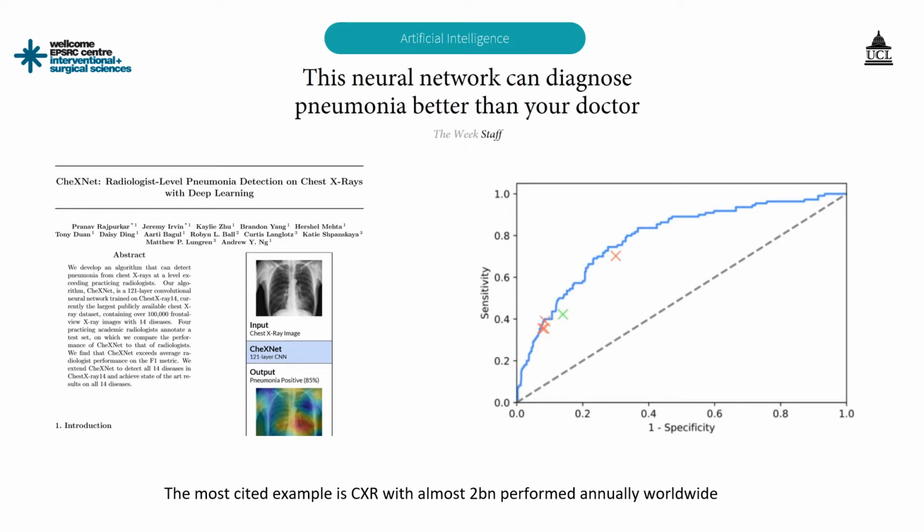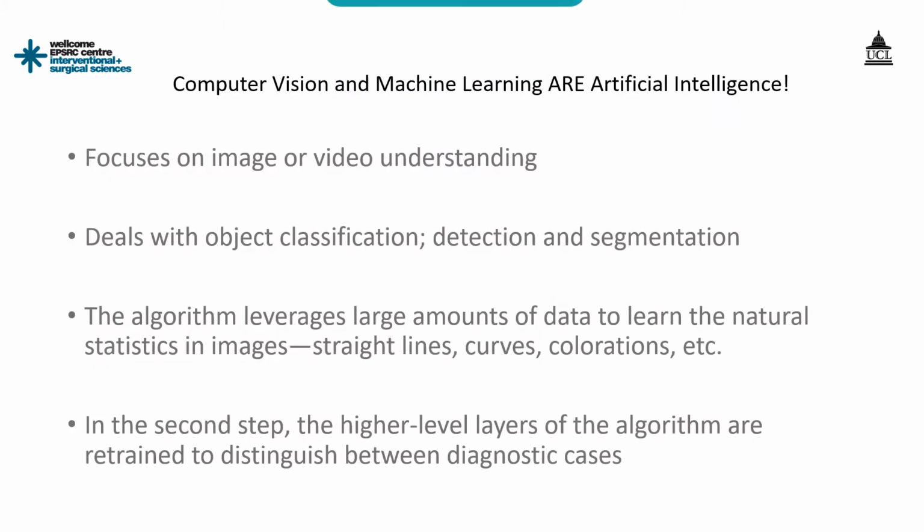Where it begins to falter is if there's more than one diagnosis, for example. So we're not eliminating the need of a radiologist to check, but perhaps it is a way for computers to identify patterns faster and more efficiently, allowing the radiologist to be better deployed from a resource point of view, and then simply double check the results.